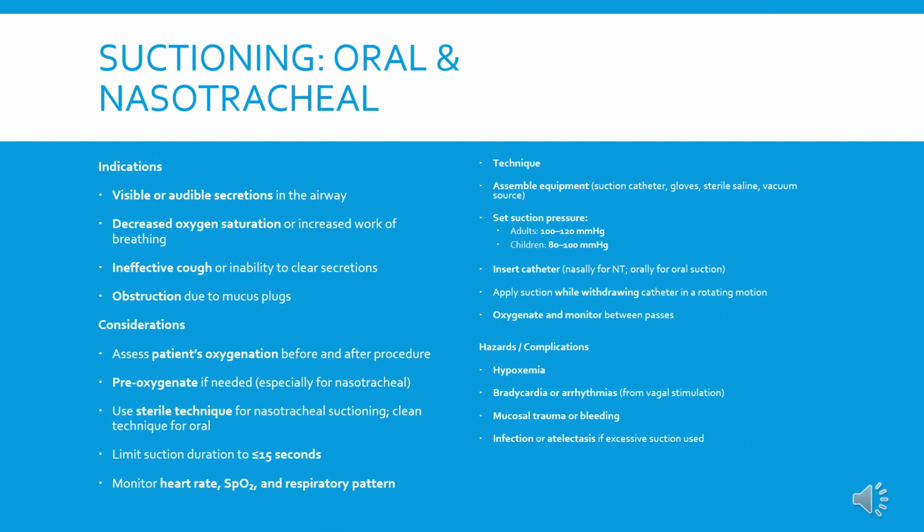And nasotracheal suctioning. Some indications for this are visible or audible secretions in the airway, decreased oxygen saturation or increased work of breathing, ineffective cough or inability to clear secretions. Considerations: assess patient's oxygenation before and after the procedure.